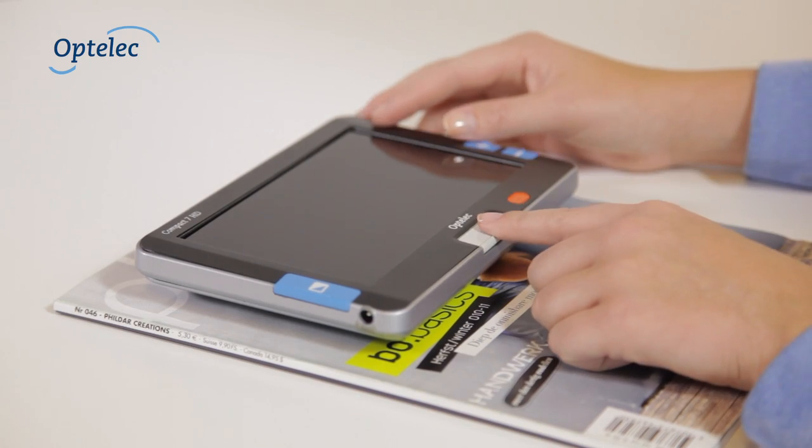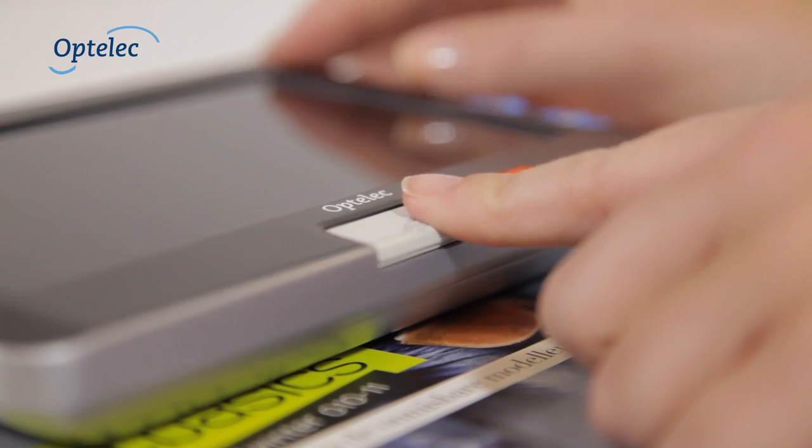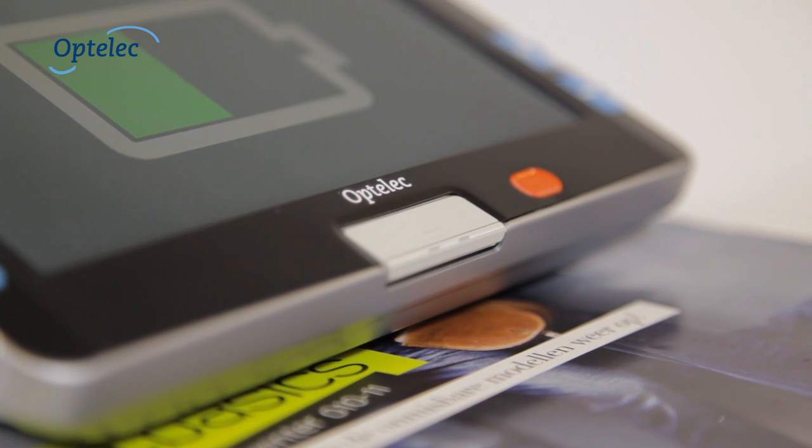The Compact 7 HD will automatically turn on when you open the unit. To open the Compact 7 HD, press the large button underneath the screen.